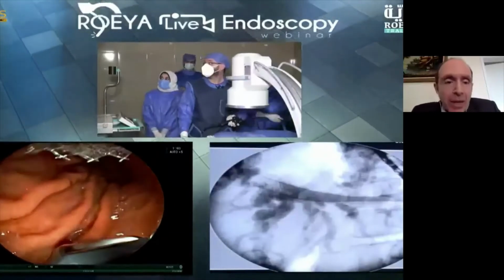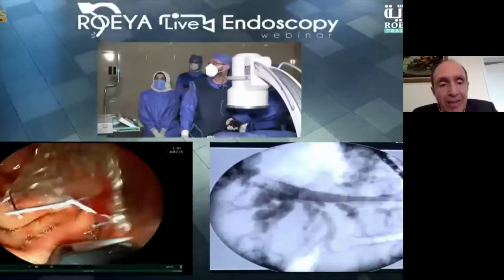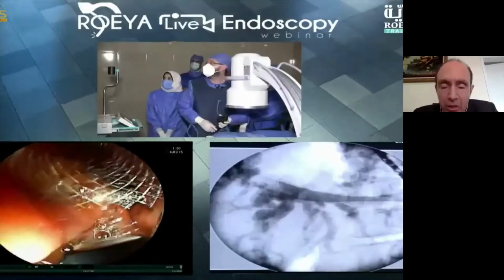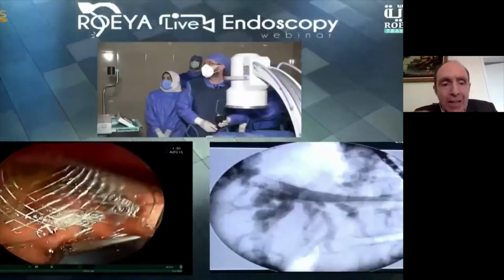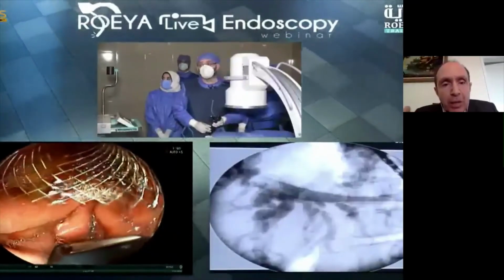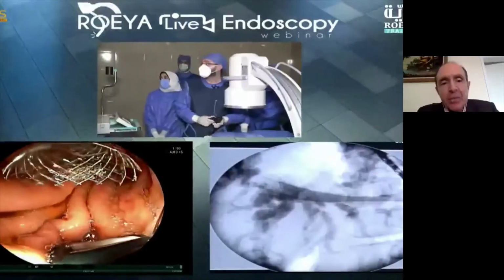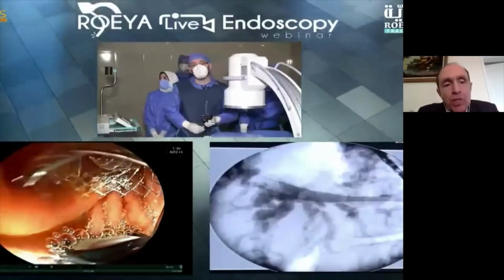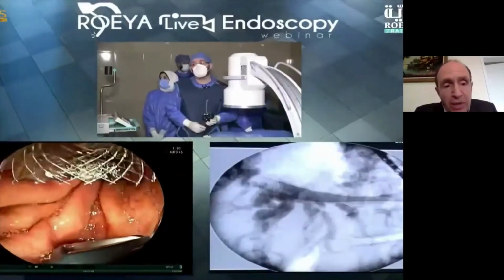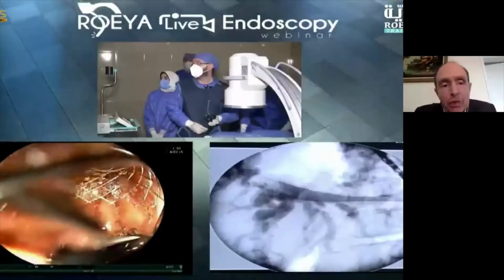Okay, so in my limited experience with this procedure, I'd rather use a 10 centimeter long stent. I know that Boston Scientific produces this stent, so a 10 centimeter partially covered stent would be better, just to be sure that you could keep a larger portion of the stent inside the stomach. Yes, I agree with you. With an 8 centimeter stent like this, I would feel safer to insert a pigtail stent. But in this case, it's a very nice demonstration. It's a very nice position of the stent. Maybe you could leave it this way.